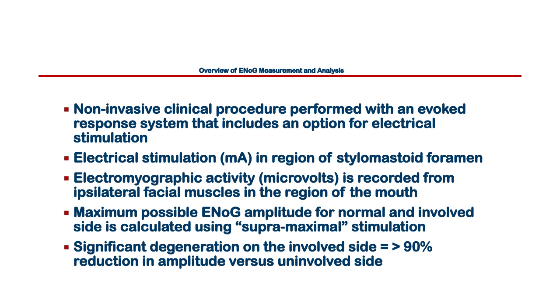Okay, it's non-invasive. It's not puncturing the skin. In a clinic, you don't do that. Now, if I'm performing facial nerve monitoring in the operating room, I do take subdermal needles and slip them underneath the skin near the nerve. But clinically, it's non-invasive. The stimulation is not sound, obviously. It's an electrical stimulation, and the unit of how much stimulation you're presenting is the milliamp, small m, big A, milliamp. And you're presenting it in the region of the stylomastoid foramen, which I'll point out more closely in a moment.